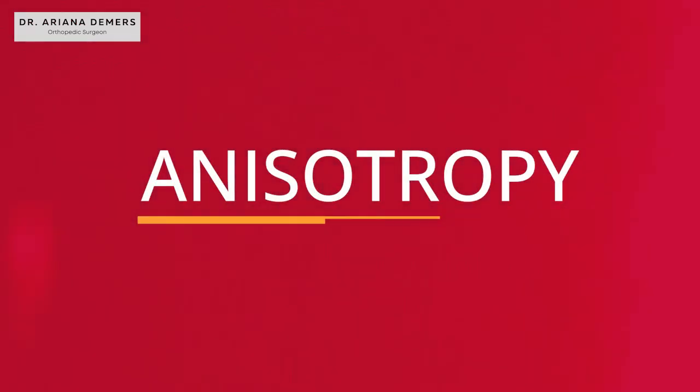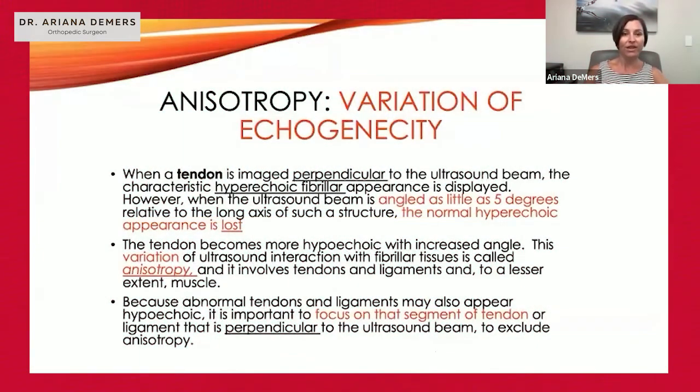So we have this thing in ultrasound called anisotropy, and it's a variation of echogenicity, very particularly in tendons, because we have to image the tendon perpendicular to the ultrasound beam, and it appears as a hyperechoic fibrillar appearance. However, when the beam is angled as little as 5 degrees from the long axis, the structure can appear abnormal. And it's unclear if it's actually an injury or if it's just anisotropy.